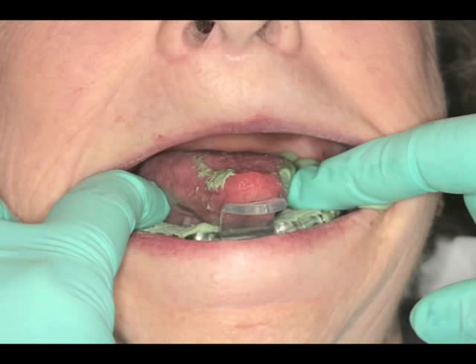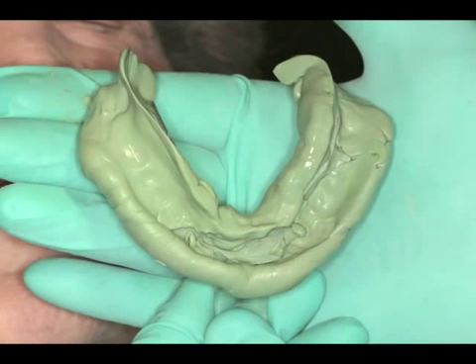We'll take our finger and thumb, pull the cheek outward. We'll then move the left and the right portions of the cheek to get the external oblique ridge, and then the anterior segment for the anterior frenum, and then have the patient pooching and smiling to now redefine the entire peripheral roll. As seen here, we have our final border molding impression.